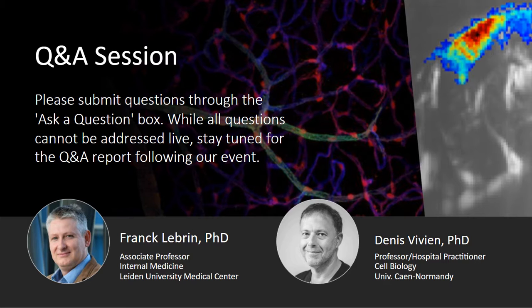Yeah, it's an interesting question. So about MR imaging for molecular imaging, the first point is to have access to particles which are biodegradable and which could be used in humans. We are working on that right now, and we have a patent on particles which are now biodegradable and could be used in humans.